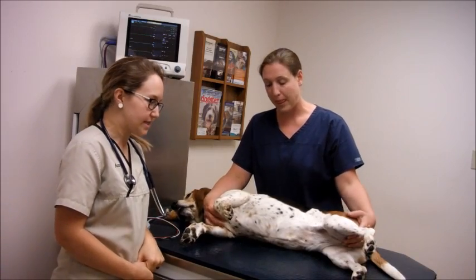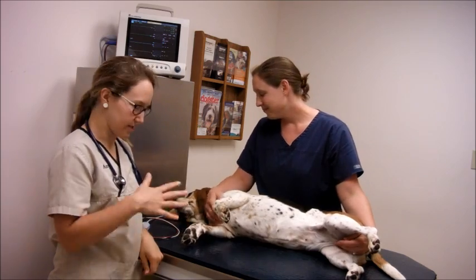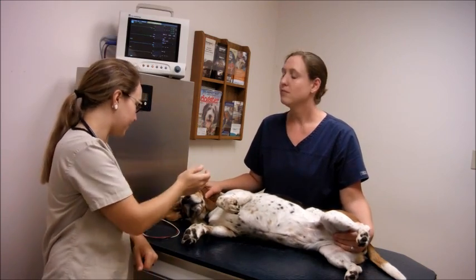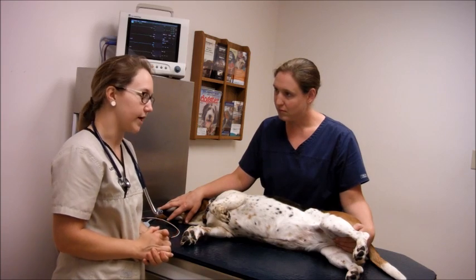Today I'll be performing an ECG on a dog. I have Lola here and Meg is restraining her for me. Once we get into the procedure, she's going to hold her so that her legs are not touching each other and are parallel to her body. Her body is laying flat and her head will be facing straight forward. That's the preferred position when you're doing an ECG on a dog.